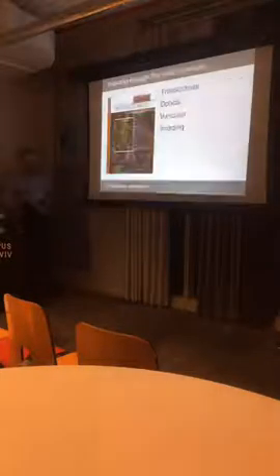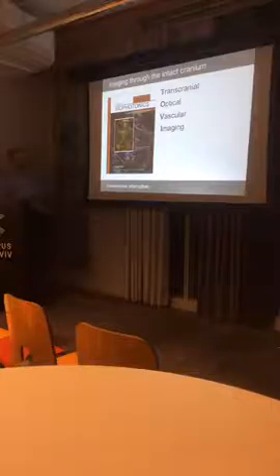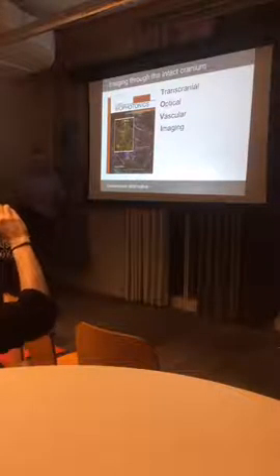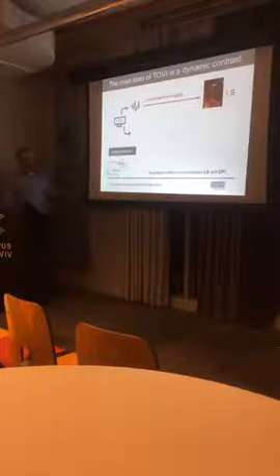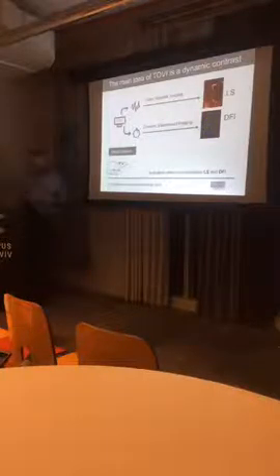So I would like to show you some of our results. We call it Transcranial Optical Vascular Imaging, and it is an inexpensive alternative to other techniques. This technique is based on exactly what I talked about a little bit before: the combination of laser speckle imaging, where we use laser speckles as a reference, with dynamic fluorescence, like I showed you on the mouse ear.